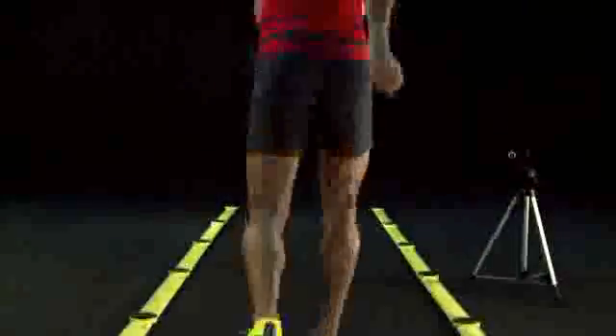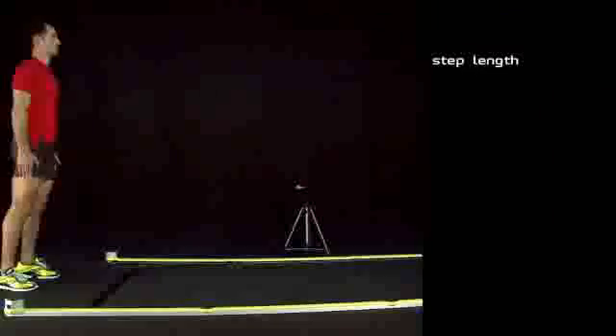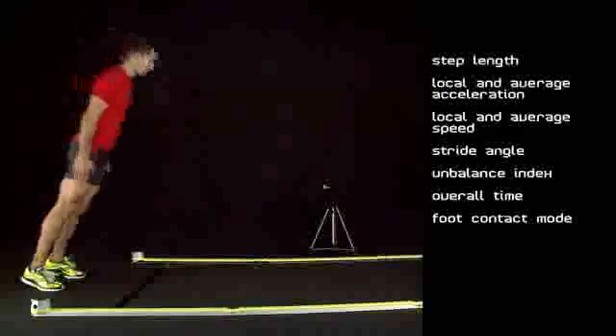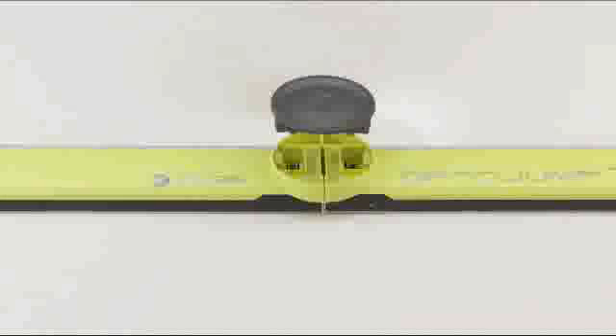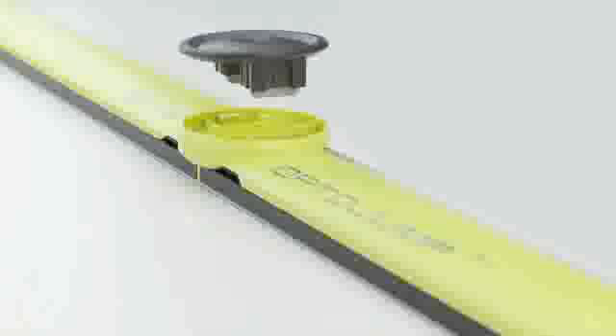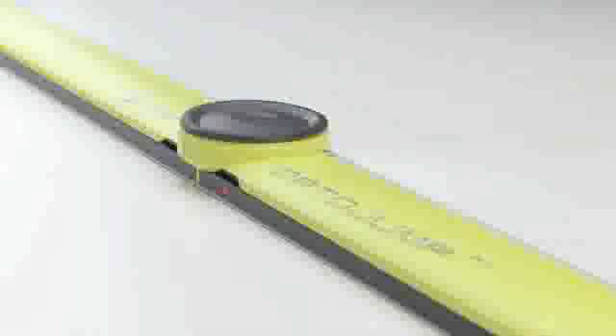In addition to single meter data, this system can measure step length, local and average acceleration, local and average speed, stride angle, unbalance index, overall time, and foot contact mode. The modular system can be installed in a few minutes, thanks to the practical and innovative cap assembly, with no connection cable or external supply.